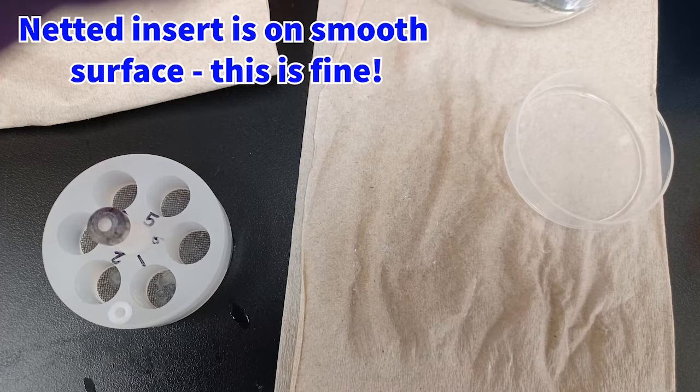Instead, you want to rest your netwells, especially when there are sections in them, on a nonabsorbent smooth surface such as this tabletop. This is fine. You can always clean up the residual water or other solutions with a paper towel and some cleaning agents later. Alternatively, you can rest it on a dedicated tray where certain residues can accumulate and then be cleaned off later if the countertop is not okay.